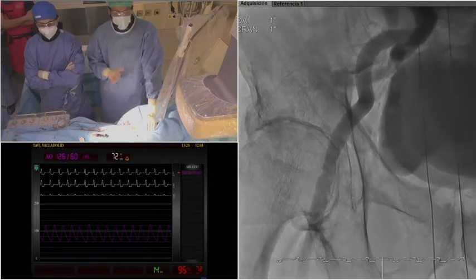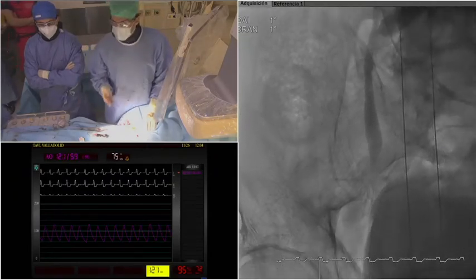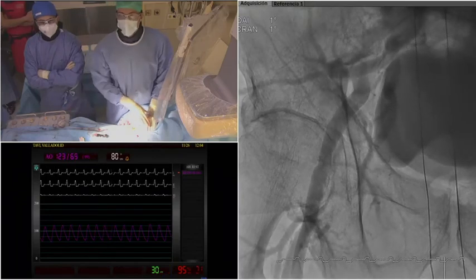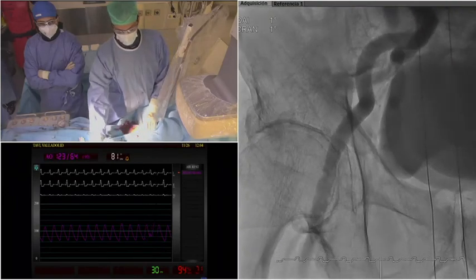And now this patient will go to the hospitalization, not the critical care unit, because we are doing this normally and also because of the COVID-19 situation, and probably tomorrow we will send him home. Yes, this is absolutely great.